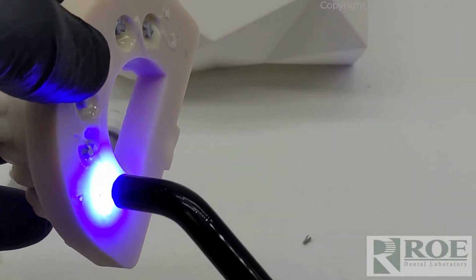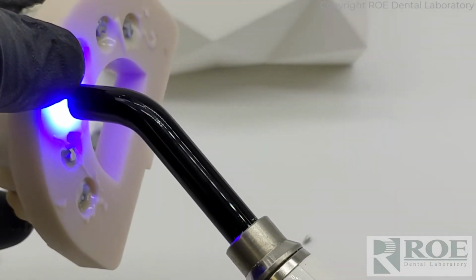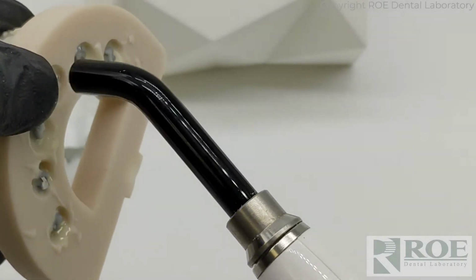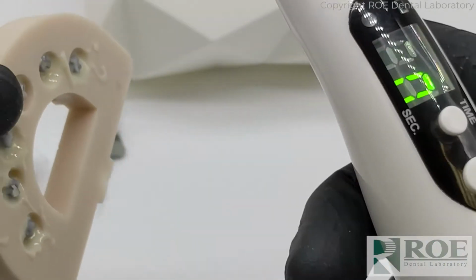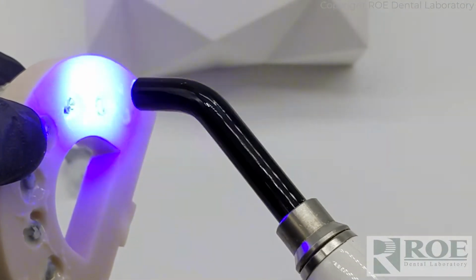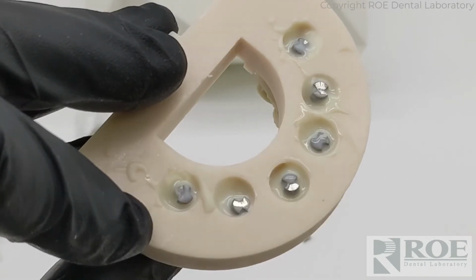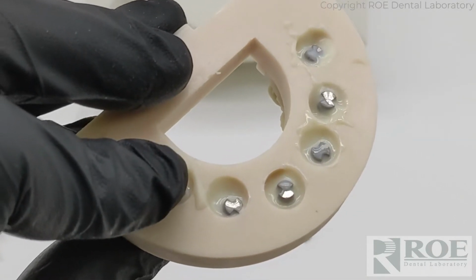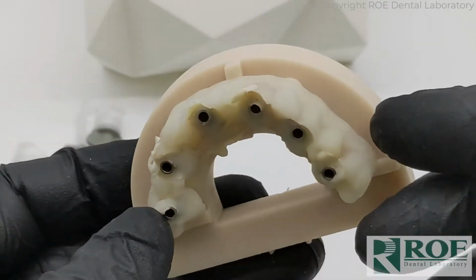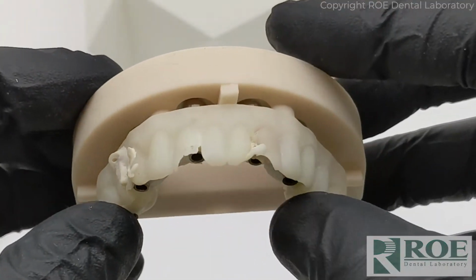Stellar is a 20-second full cure with a light. Some lights are more powerful than others, but 20 seconds will have it really well tacked in. Okay, so I'm going to keep curing this. Okay, they're all filled in. Looks good. I think I'm going to stick with that. Probably won't fill any more material in. And this is down here, so we know we are good to go.